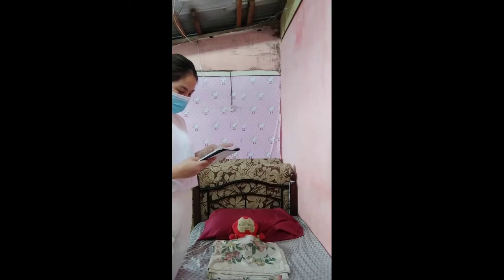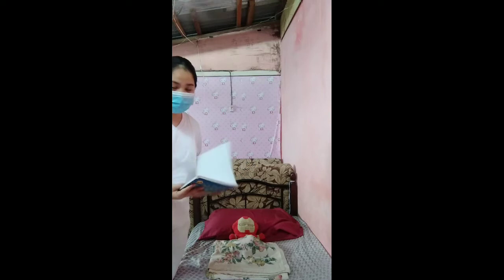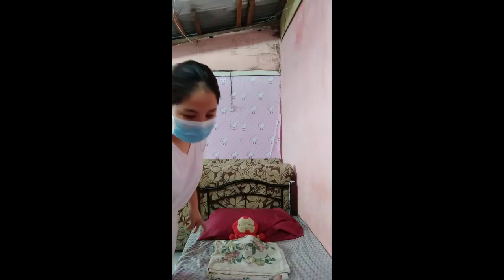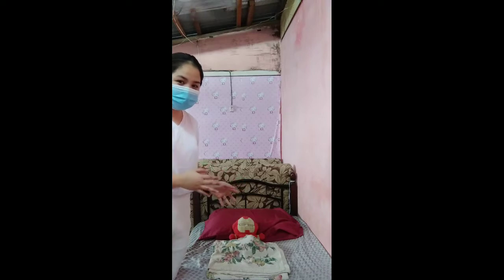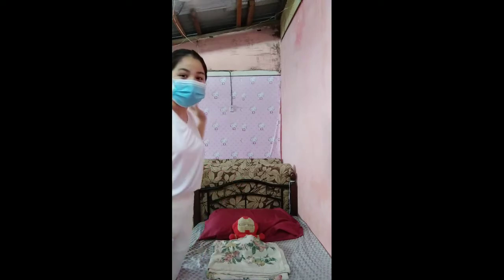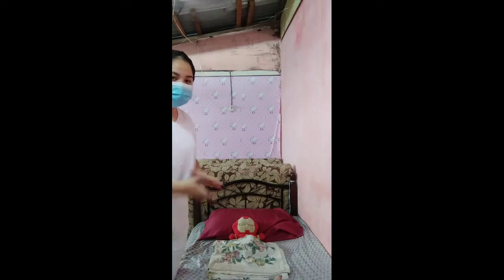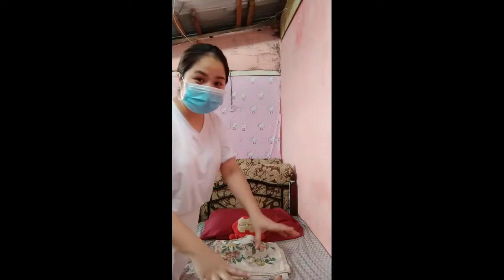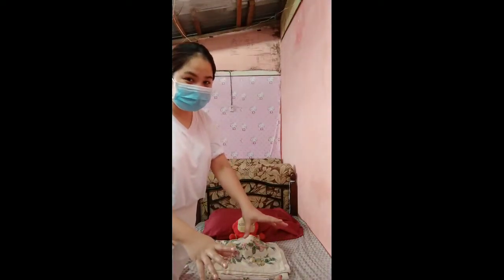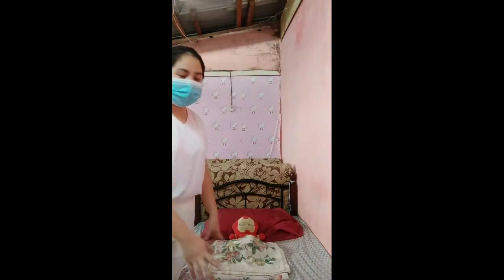Okay, perfect. After verifying the doctor's order, we need to ensure the privacy of the patient for this procedure. So we need to close all the curtains at the side of the bed of the patient. After that, we need to prepare all the materials. And here are the materials for the catheterization procedure here at the bedside of the patient.